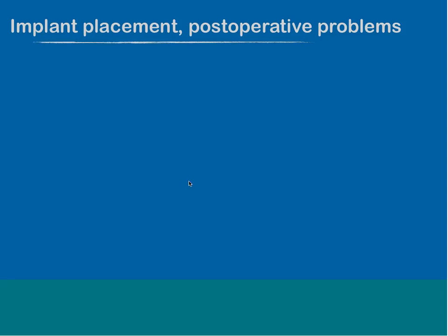And finally, we look out for some problems due to implant placement and some postoperative problems prior to implant placement. And both of the cases are severe ones. So we check out for the penetration of the mandibular canal. You all can imagine that there mustn't be a situation like that. The implants can penetrate the mandibular canal, but they don't have to.